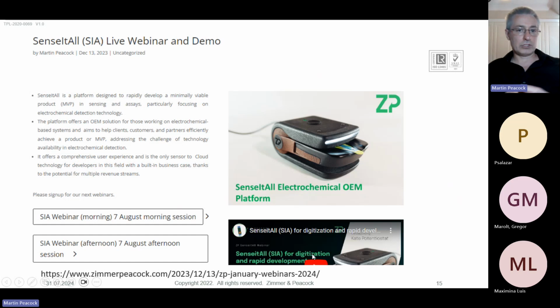I was at a conference this week, IEEE Biosensors, and anyone who knew anything about wearables was talking about artifacts. When you've got something on your wrist, like I am today, this is a wearable microneedle system. Just moving your arm will put movement into that system. Any kind of liquid movement will be a spike in your glucose signal, for example. And you've got a lot of data cleanup to be able to do.